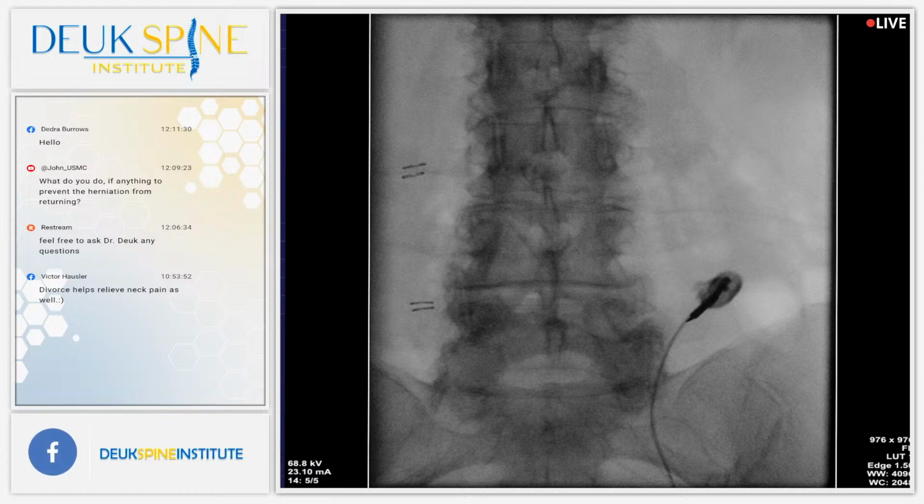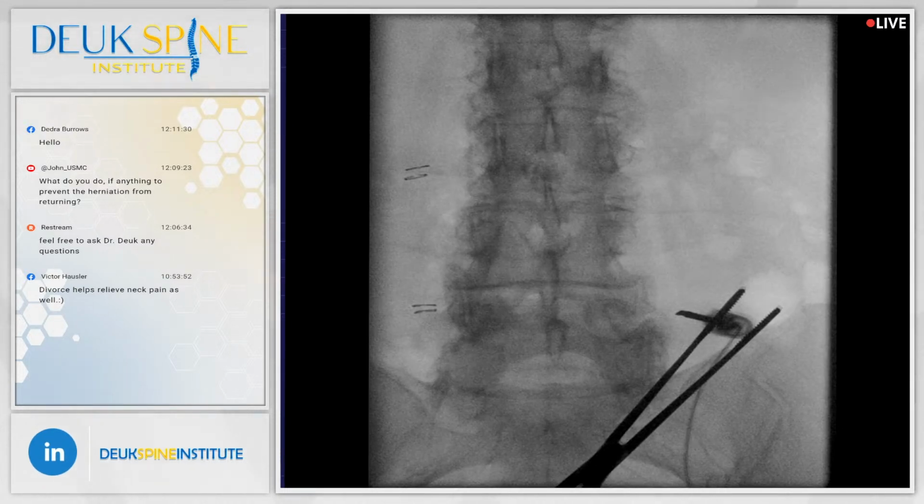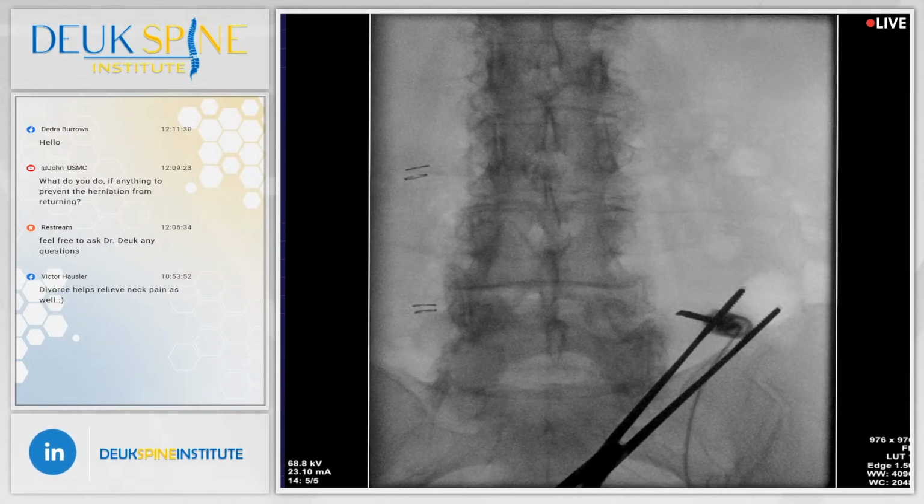Her arthritis is really bad. That should be the spot right there. Think that will do it. We're going to move on to the next area, the SI joint. So to answer your question, behavioral modification for a period of time while the body heals.